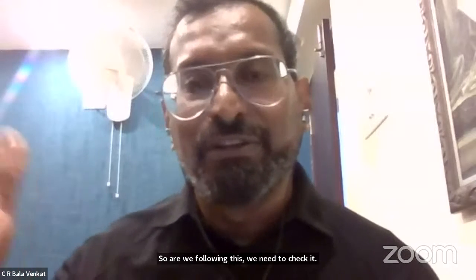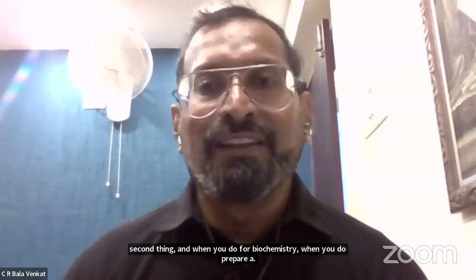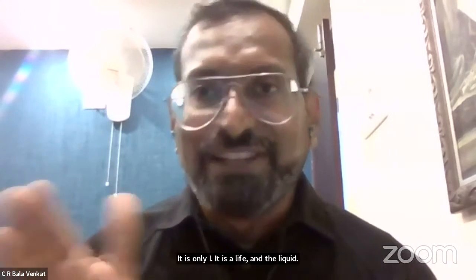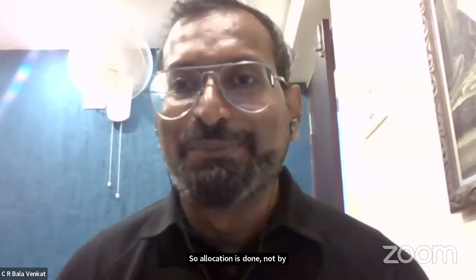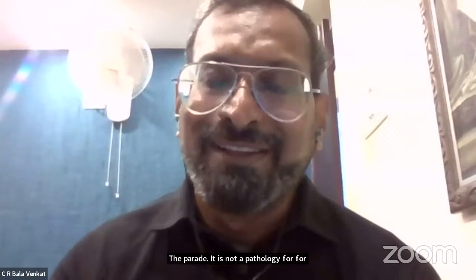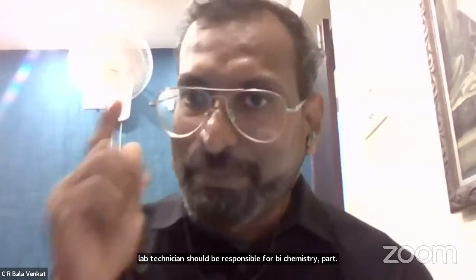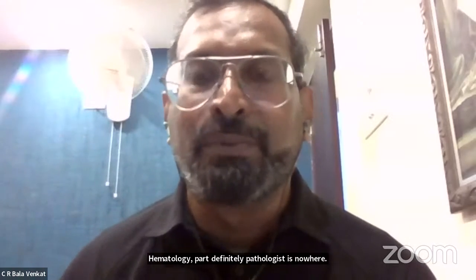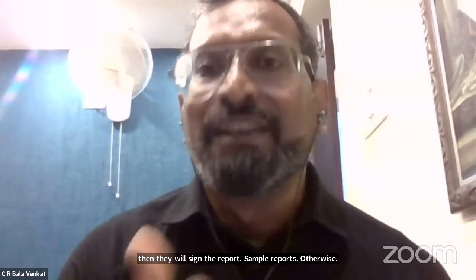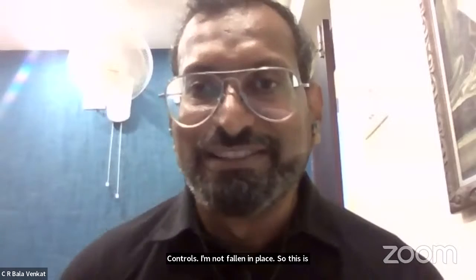And second, when you prepare a calibrator or control for biochemistry, it is lyophilized and aliquoted. Aliquoting is not done by a pathologist. For biochemistry, only our lab technician should be responsible. In the hematology part, the pathologist is definitely not involved. The pathologist will verify whether controls fall in range, and then they will sign the sample reports. Otherwise, they will not sign the report because controls have not fallen in range. So this is the primary question. Hope I answered this one.